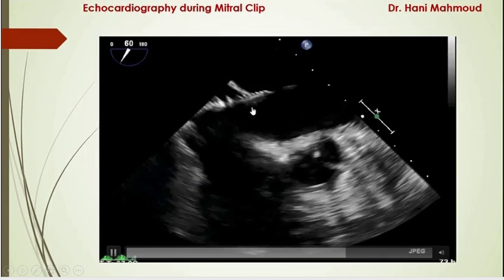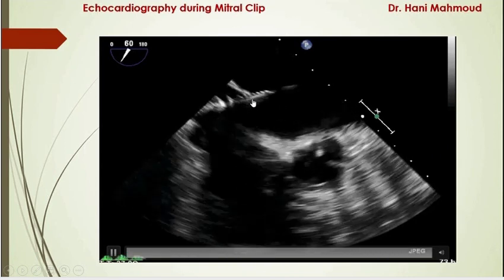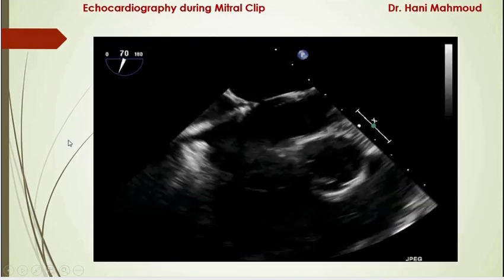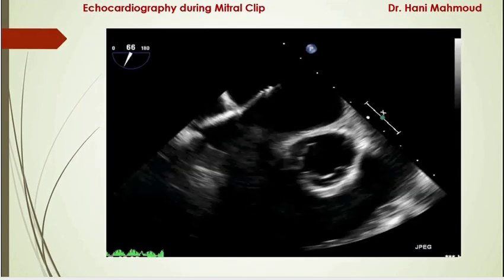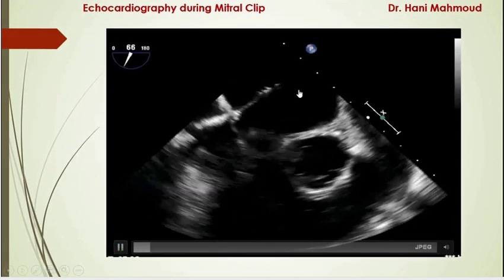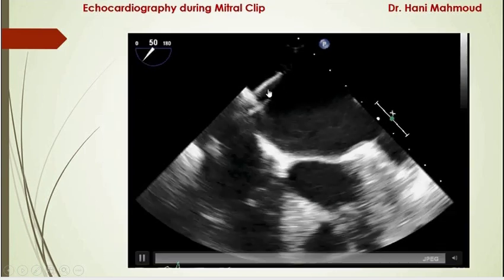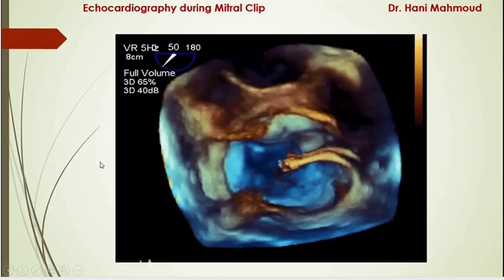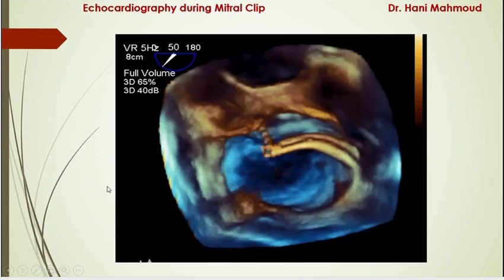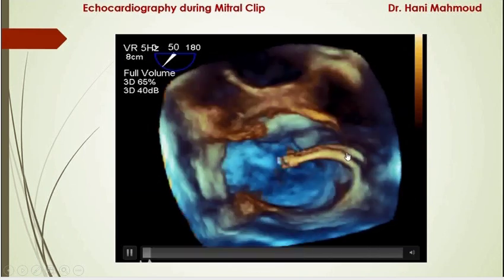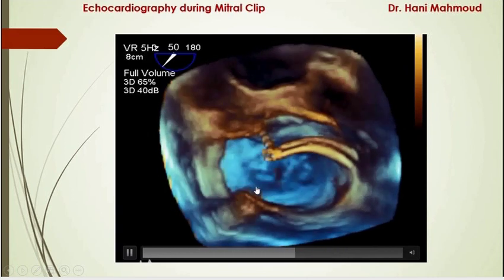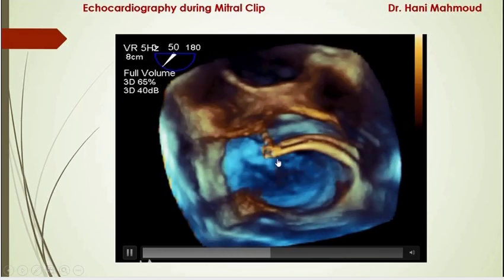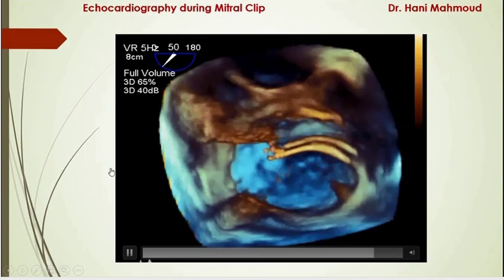The needle is then introduced, and we should see the characteristic echo tent sign inside the left atrium to confirm that septal puncture happened correctly. After that, the interventionist introduces the sheath over the needle and withdraws the needle. The sheath remains inside, and sometimes you will be asked to measure its depth inside the left atrium. In the 3D live view, we can see the catheter coming through the intra-atrial septum into the left atrium, and monitor the movement of the sheath and the clip as it comes out of the sheath.